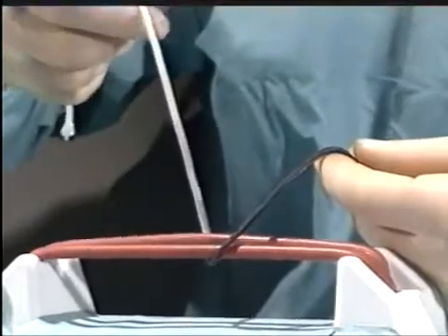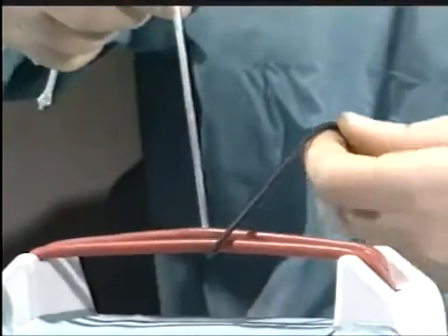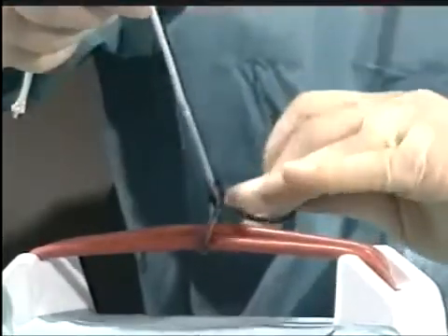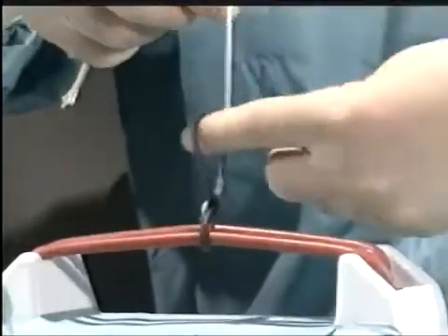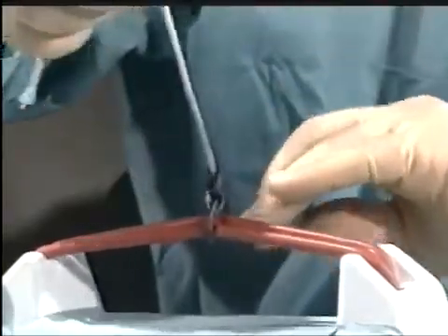One other common fault is for the surgeon to hold one end of the suture up and tie round it. And although they may appear to tie alternate knots and cross their hands, they are actually tying round the suture.